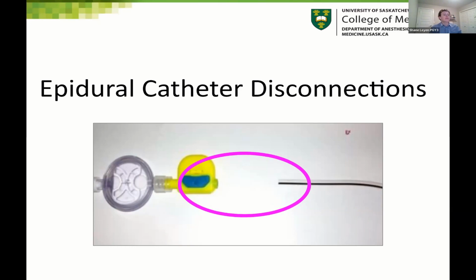Just to make sure we're all on the same page, when I refer to catheter disconnection, I am referring to the catheter itself being disconnected from the hub, not the hub being disconnected from something more distal, such as tubing or a bacterial filter.